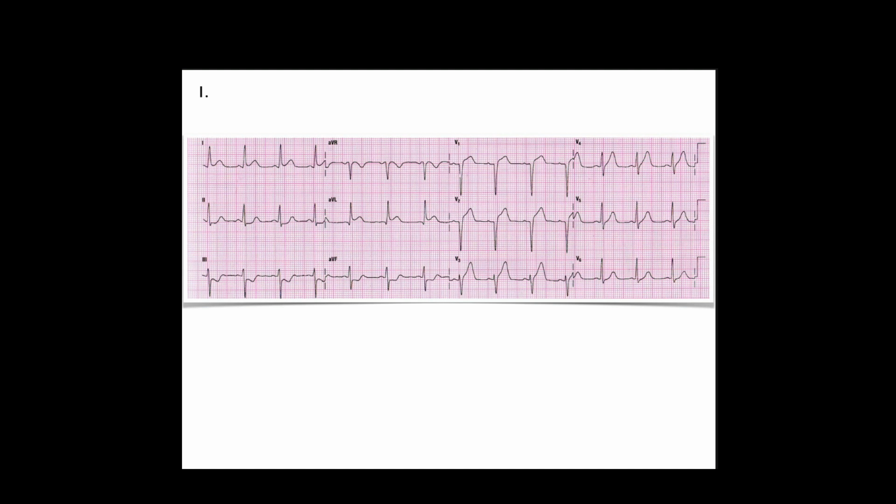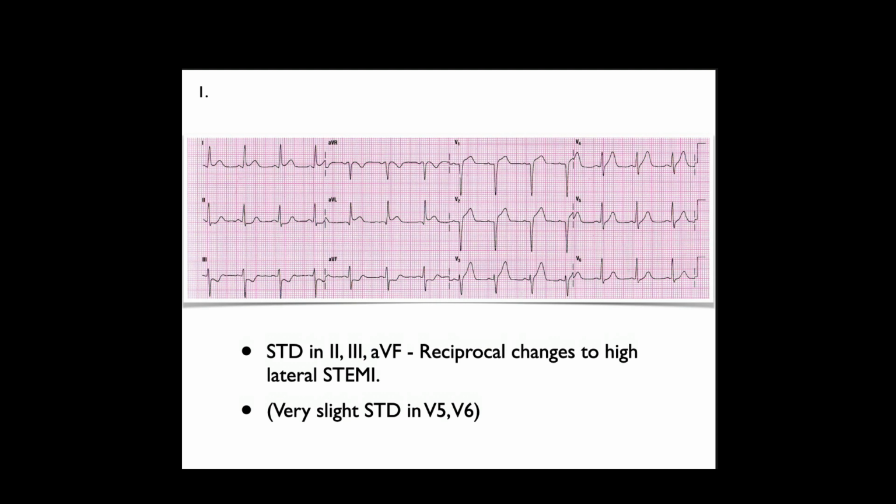Hold on. Okay. There might be a possible posterior, sorry, no. There's a septal. Yeah, you're correct about that. I'm just going to jump in here. You're correct that there is, and certainly if you were given this 12 lead, that would be a very important finding.